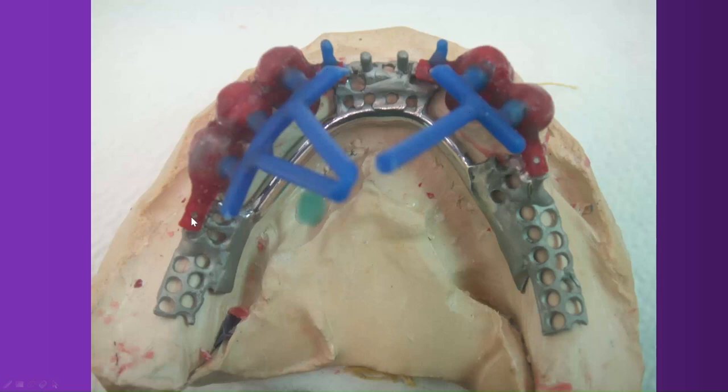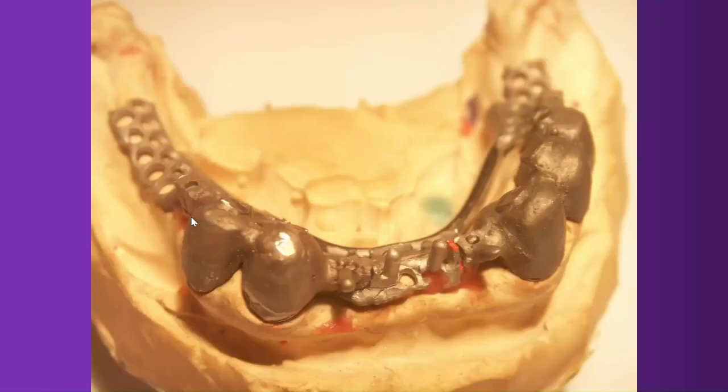Look again. That's the final shape. You see the reinforcements for the denture teeth in the frontal region. Gold palladium cemented by these conjunctors with the main cobalt chromium connector.